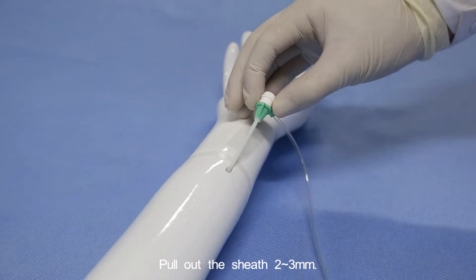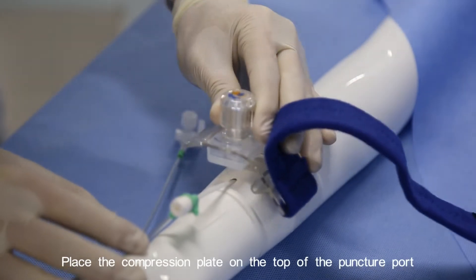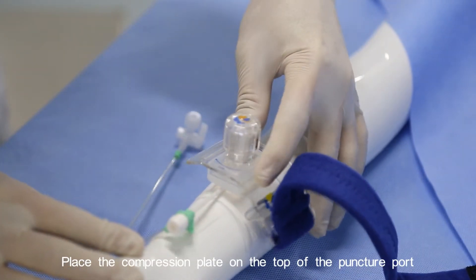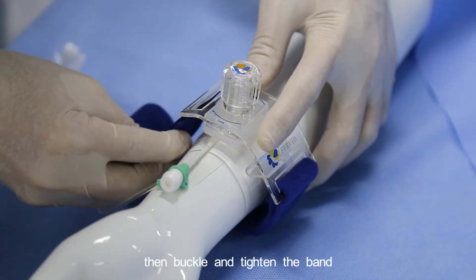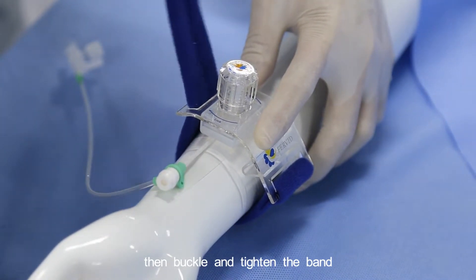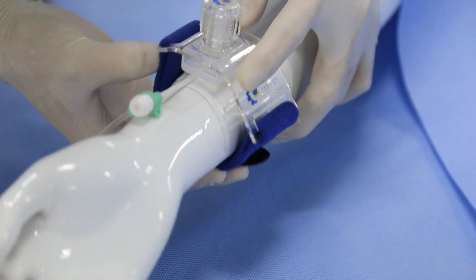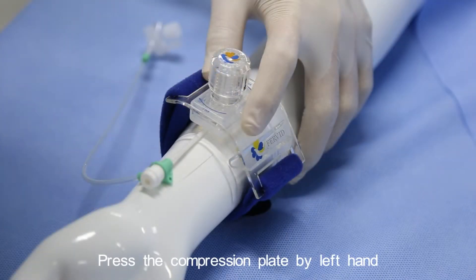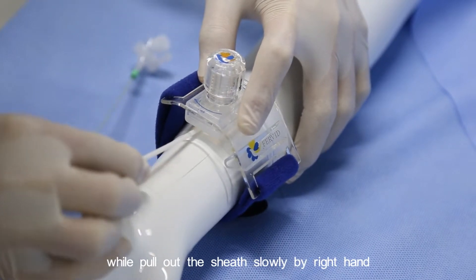Pull out the sheath two to three millimeters. Place the compression plate on top of the puncture port, then buckle and tighten the band. Press the compression plate with the left hand while slowly pulling out the sheath with the right hand.